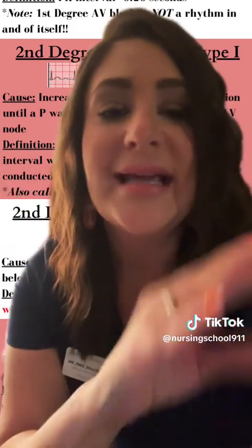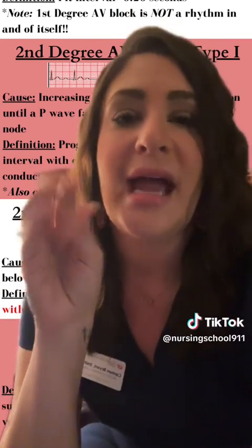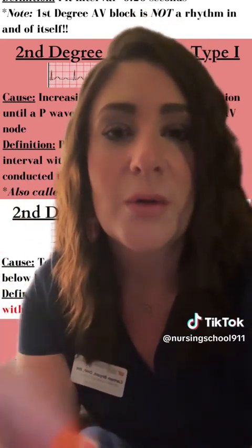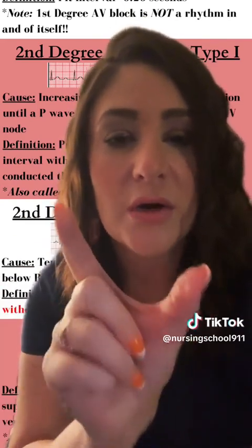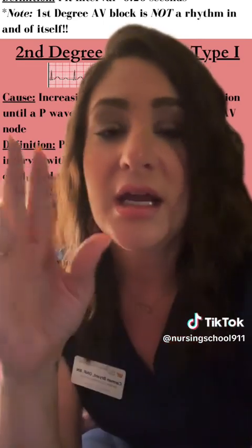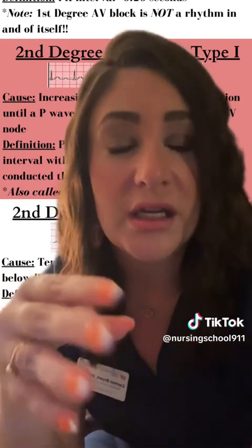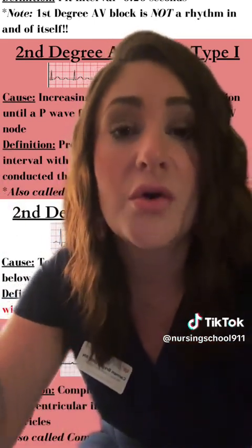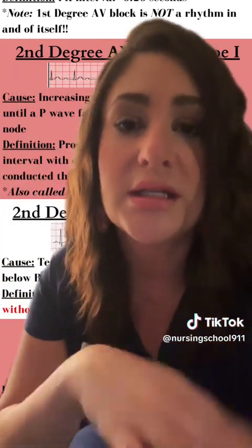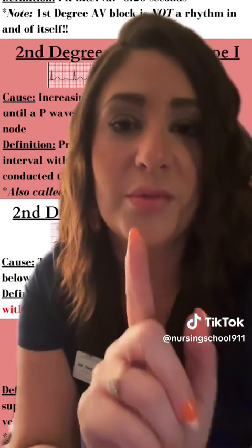All it is is abnormally slowed conduction through the AV node, evidenced by a PR interval that is greater than 0.20 seconds, okay? Conduction is still happening. Every impulse is being conducted from the SA node down to the AV node, through the AV node, and then the bundle of His. It's just abnormally prolonged. So that's a first degree AV block.